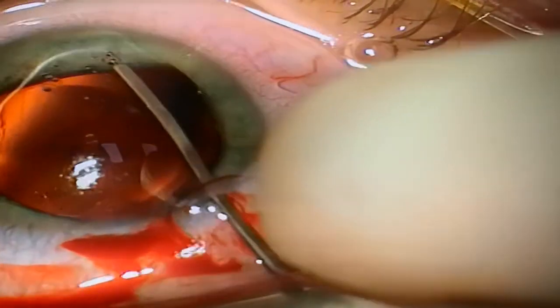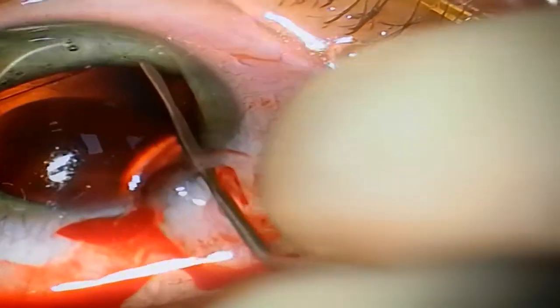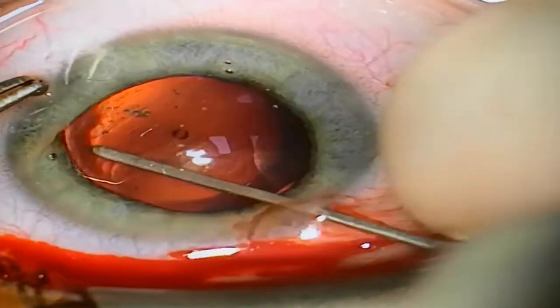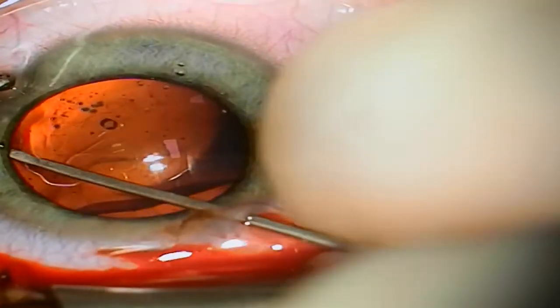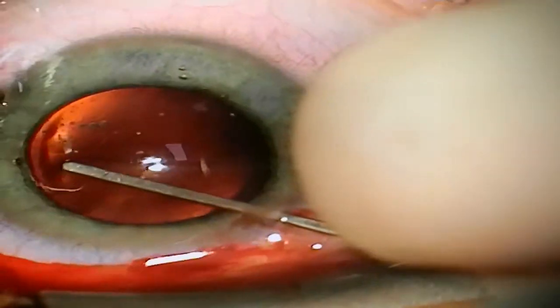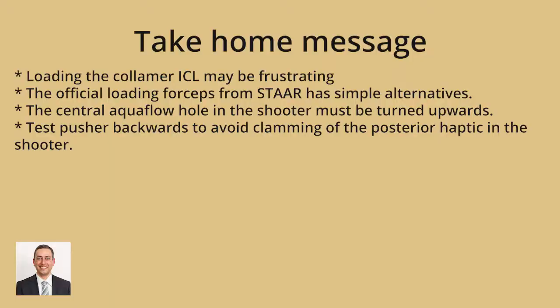Tucking the haptic is done in gentle, frugal movements. Always flat. Don't push on the crystalline lens. And using a little bit of rotation to slide the next haptic after the first one. So basically this is the normal technique. We can also fix the axis if we want.